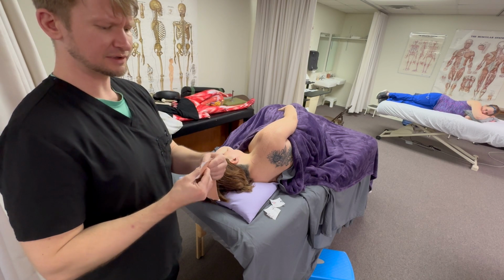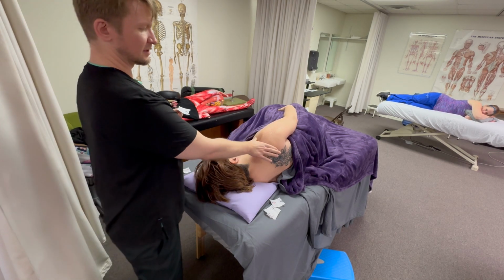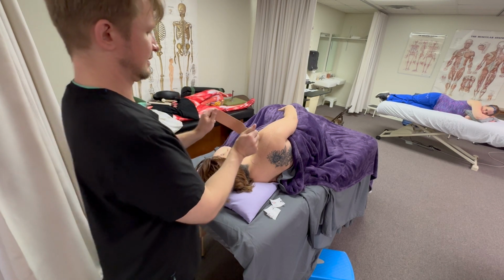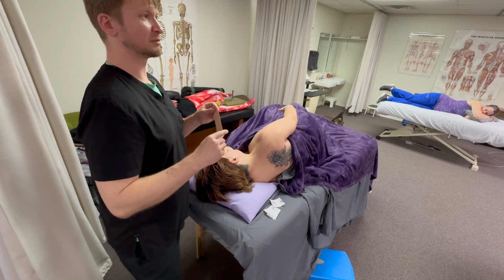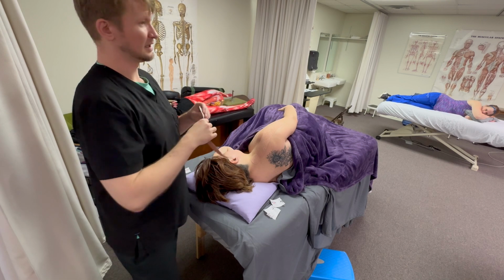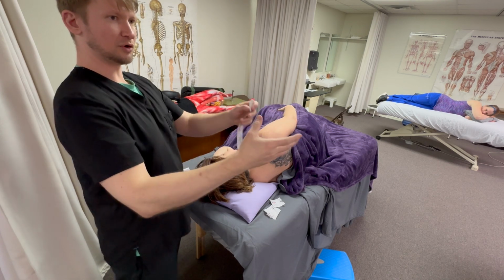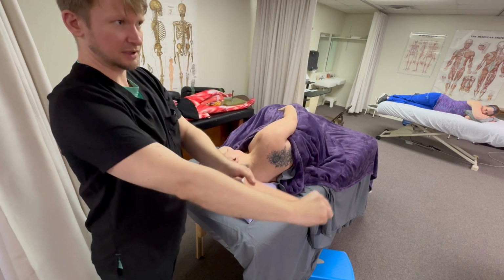This only really works in a few body areas. It works good here because I can stand and go like this all at once. It also works good for when we do the foot. So when I tape the foot, somebody laying prone, I could do the same thing of grabbing the tape and coming straight down.